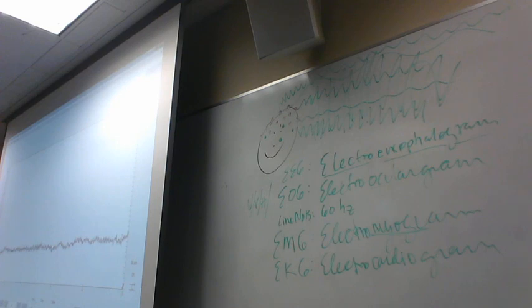And if you graph that, you can plot it like this. All right, so this would be your remember, this would be forgot. This would be at your anterior frontal site 4. And we can see that this looks like a pretty big difference between the two.